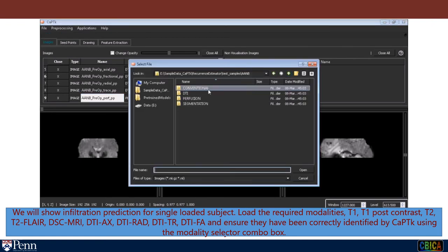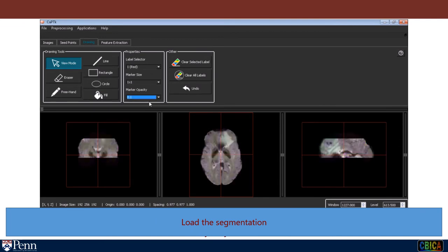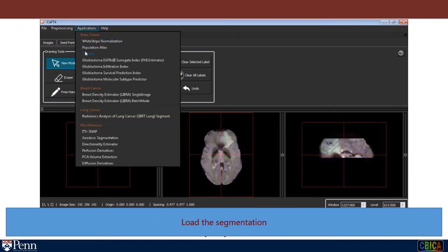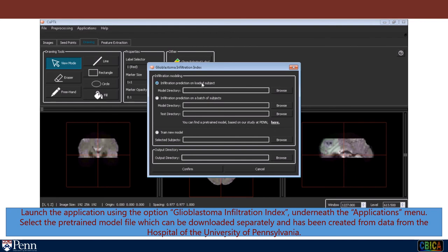Load the segmentation. Then select the pre-trained model file, which can be downloaded separately and has been created from data from the Hospital of the University of Pennsylvania.